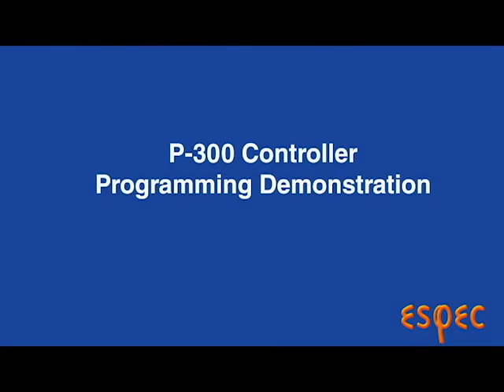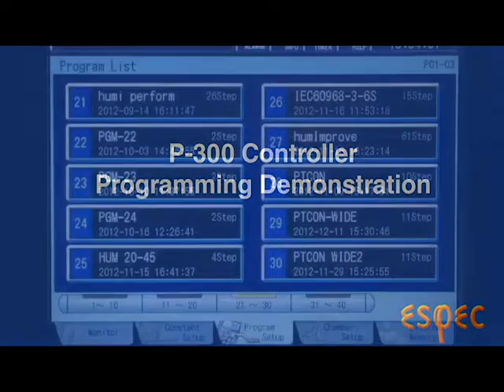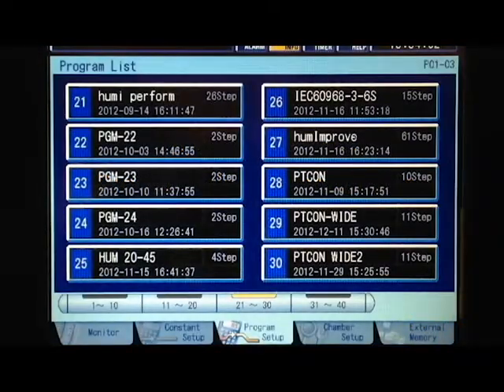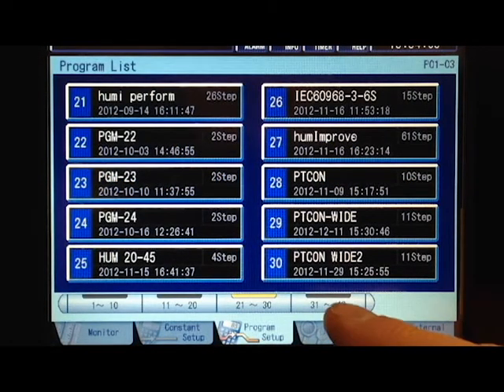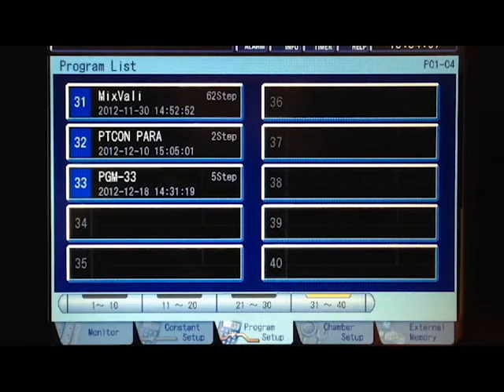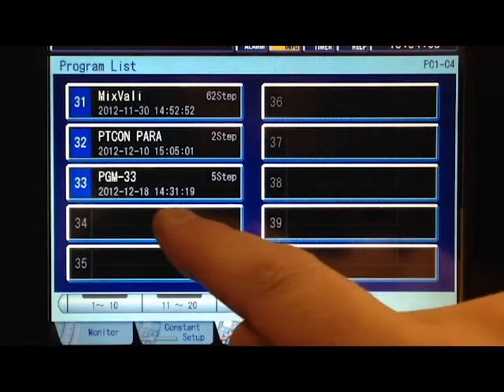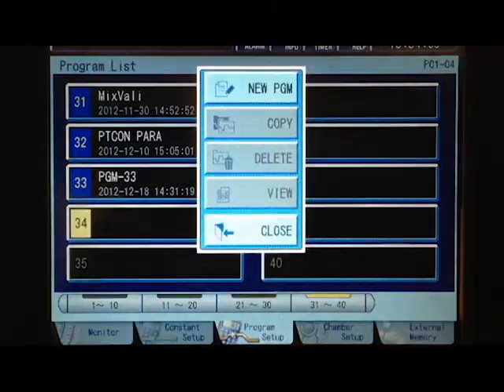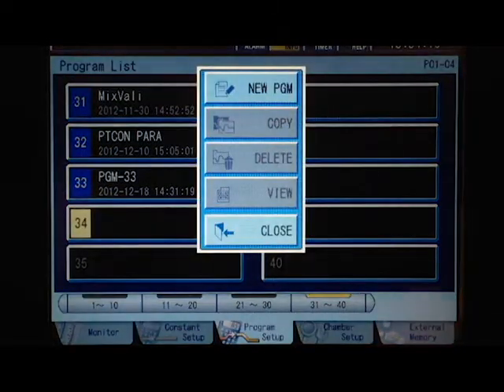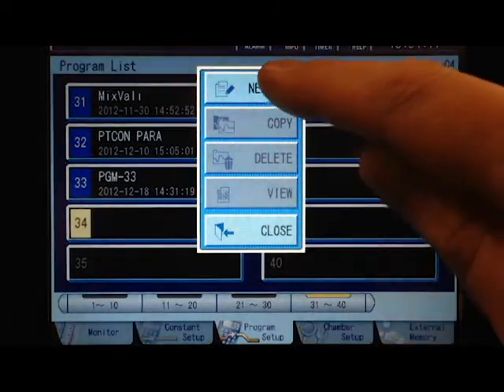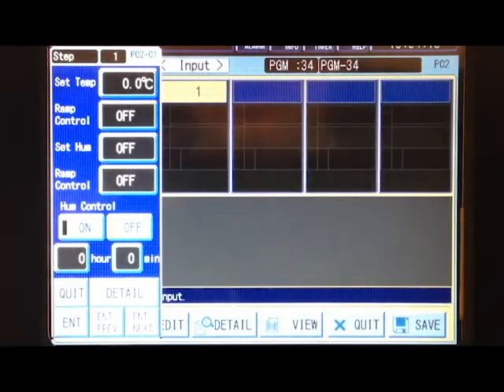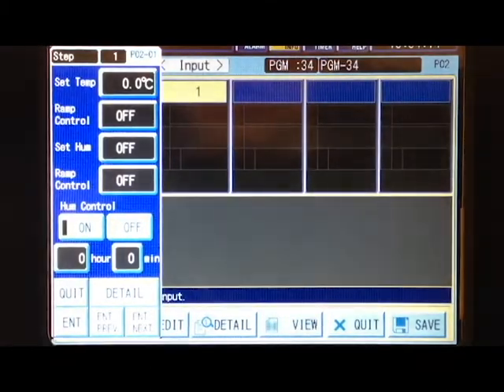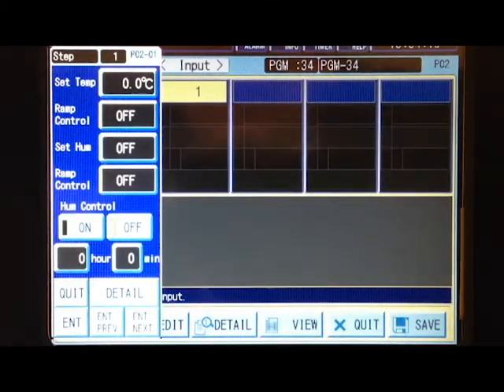We're going to show you how to program the ESPEC P300 Programmer. We're on the program list screen and we'll find an open slot. How about number 34? That looks good. Press new program and we're starting a program.